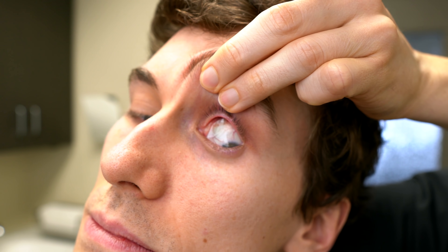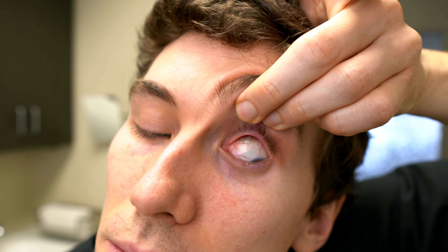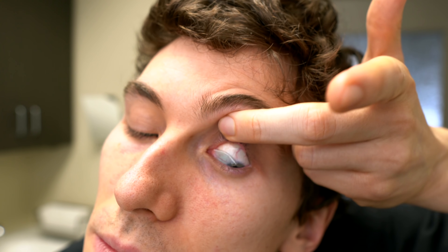If the contact lens has rolled up or folded, you can usually feel it more easily and push it down. However, if the lens is still in its normal shape and suctioned to the eyeball, sometimes not only pushing it downward but also doing the opposite — looking up toward the lens — can push it back onto the front surface of the eye. The lens tends to settle on the cornea more easily, so try looking straight or even upward to help it slide into place.